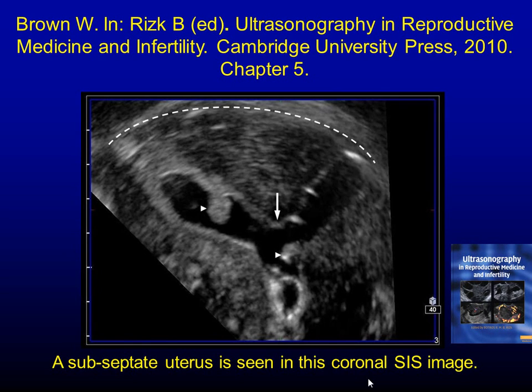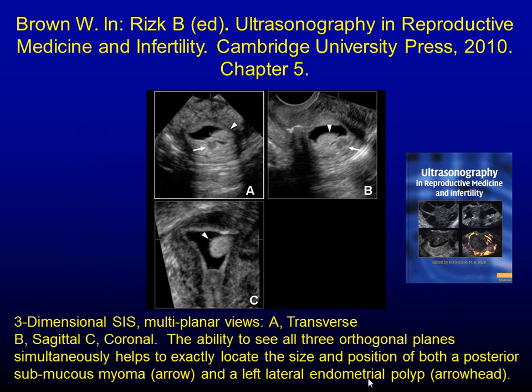And I have a beautiful video again, if your time allows, showing you the beginning of the case. You go inside the cavity, you can't figure out where you are, and then at the end you have a beautiful pear-shaped pink cavity altogether. Classic patient, again, no infertility, but she has recurrent pregnancy loss. God willing, next month we'll try and cover recurrent pregnancy loss in a nice way.